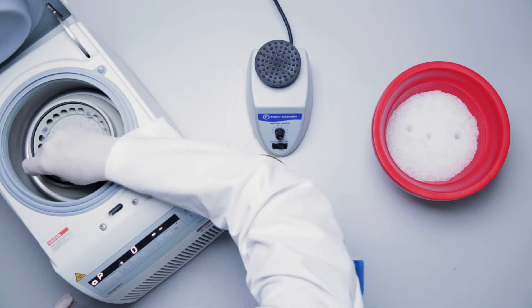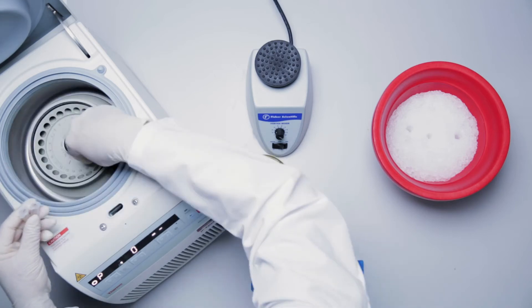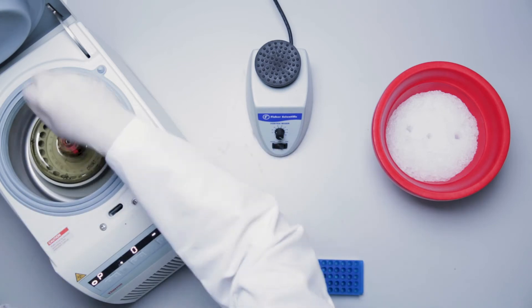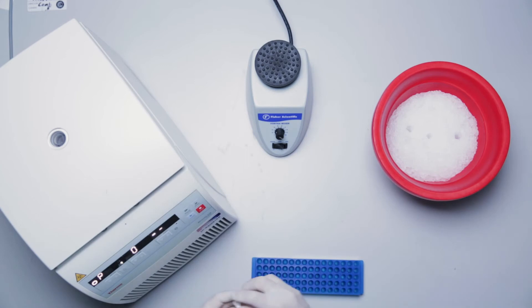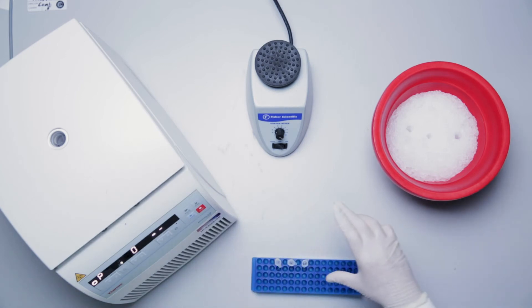If dilution is required, dilute serum or plasma samples in 1x universal assay buffer. For dilution of cell culture supernatant samples, use cell culture medium that was used to culture the cells. Be sure to note if there is a recommended sample pre-dilution factor so that it can be applied during the analysis step.